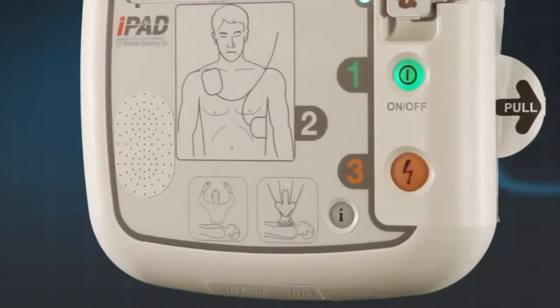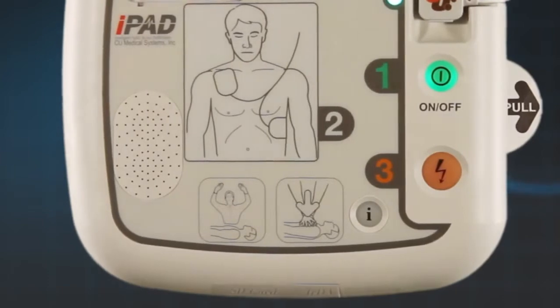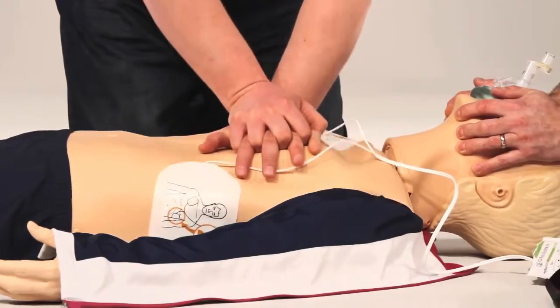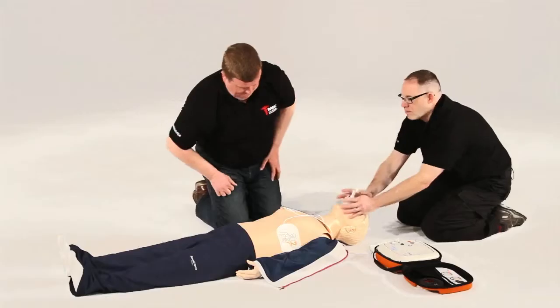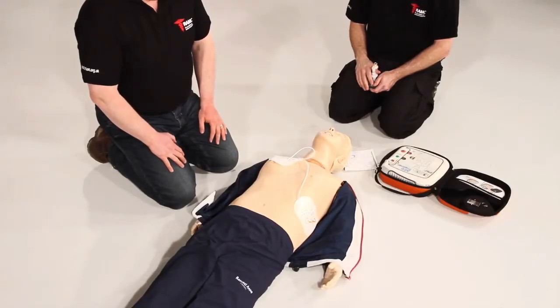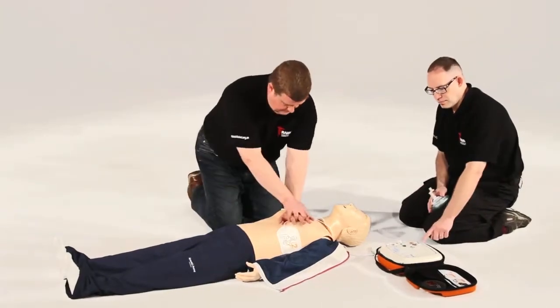The AED will also detect if CPR has been performed. Depending on what is detected, it will instruct either to commence CPR or encourage you to continue CPR. Always continue CPR until either the patient wakes up or the AED prompts you to stop so it can reanalyse — this is usually every two minutes. At times, a patient's heart may not require a shock; in this instance, the AED will state: no shock advised, begin CPR now.